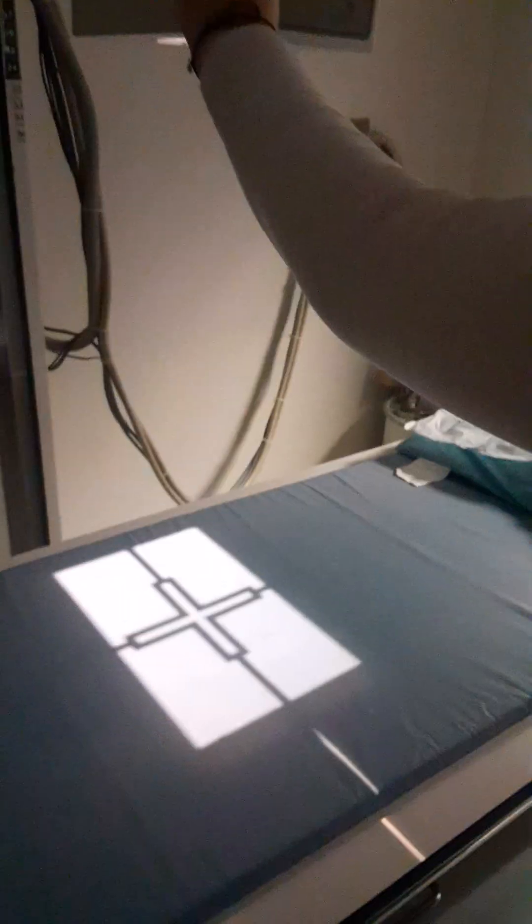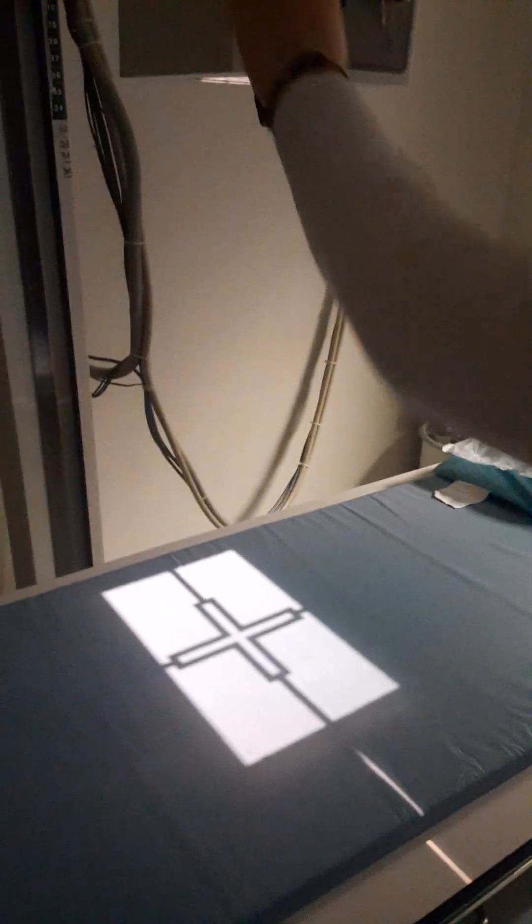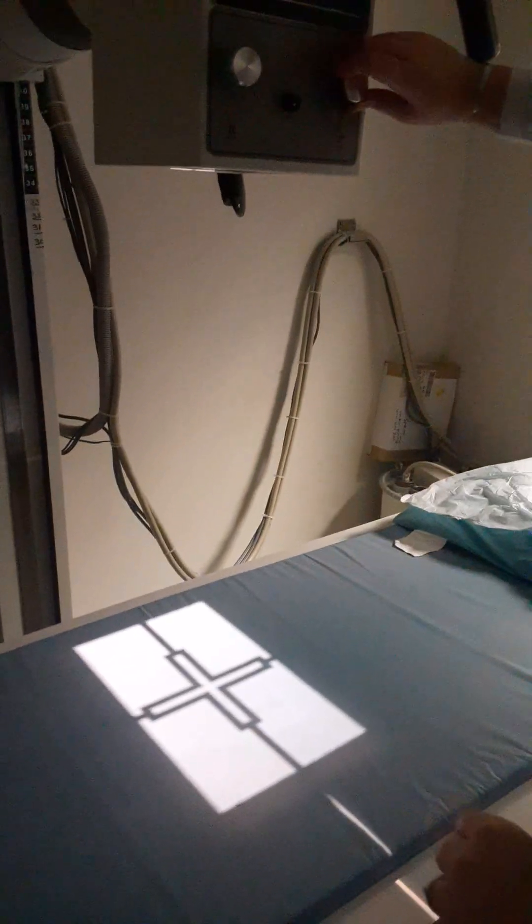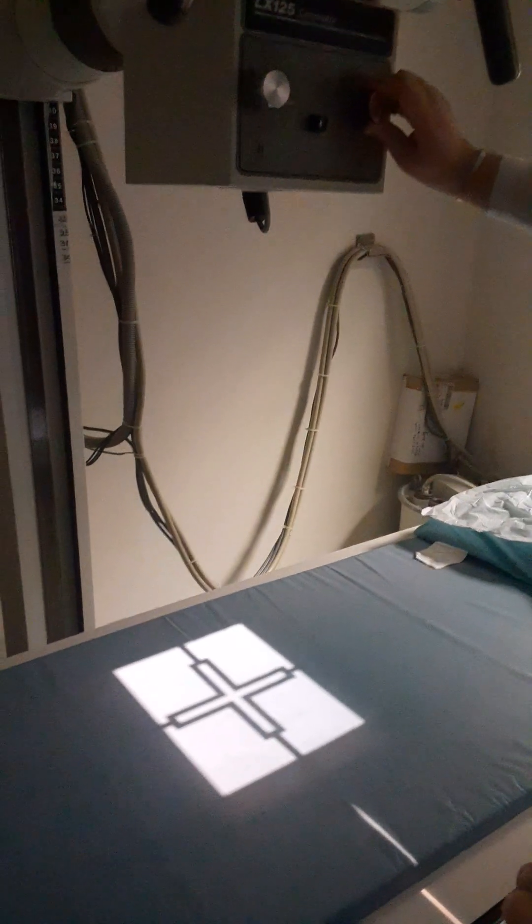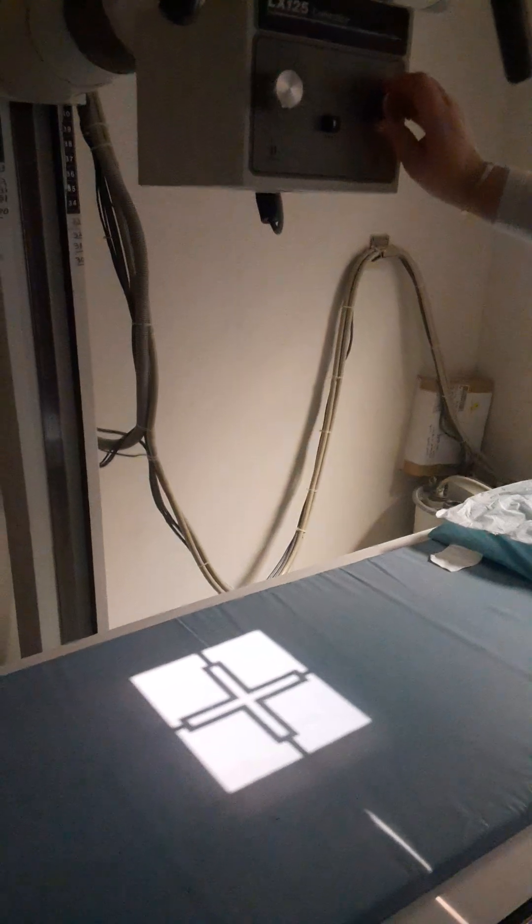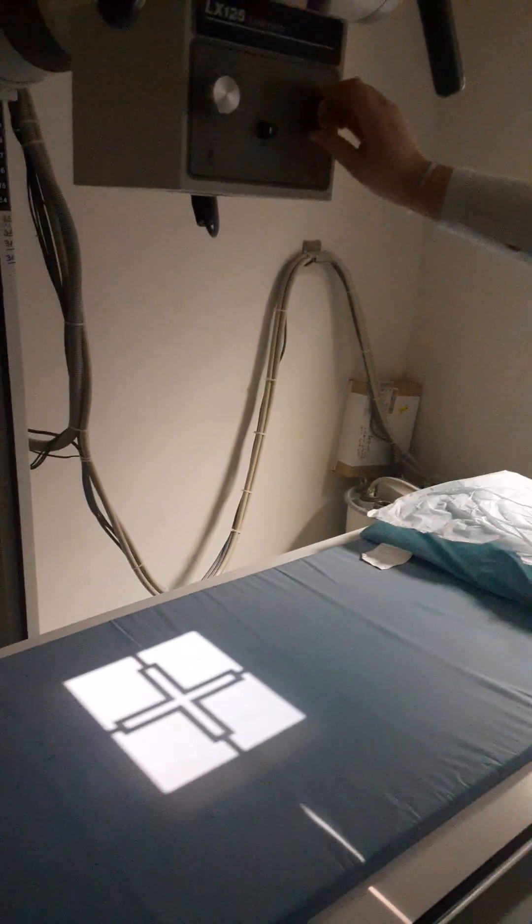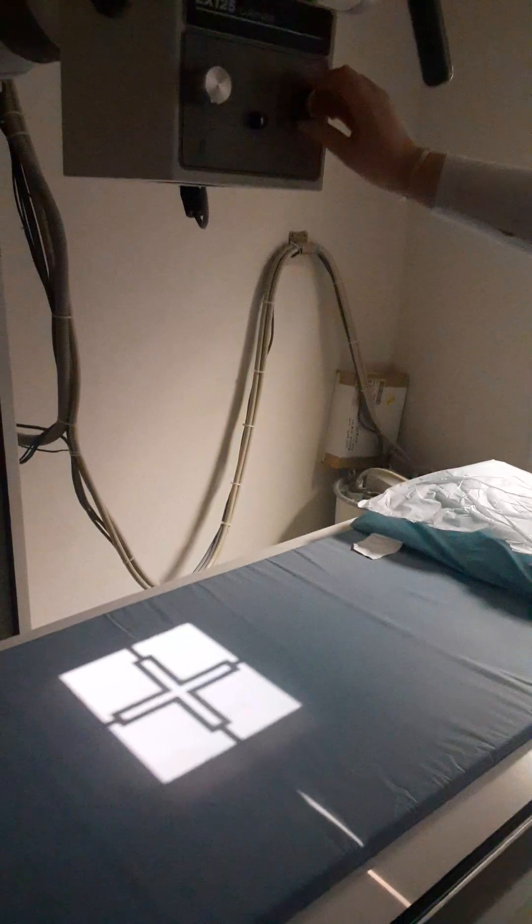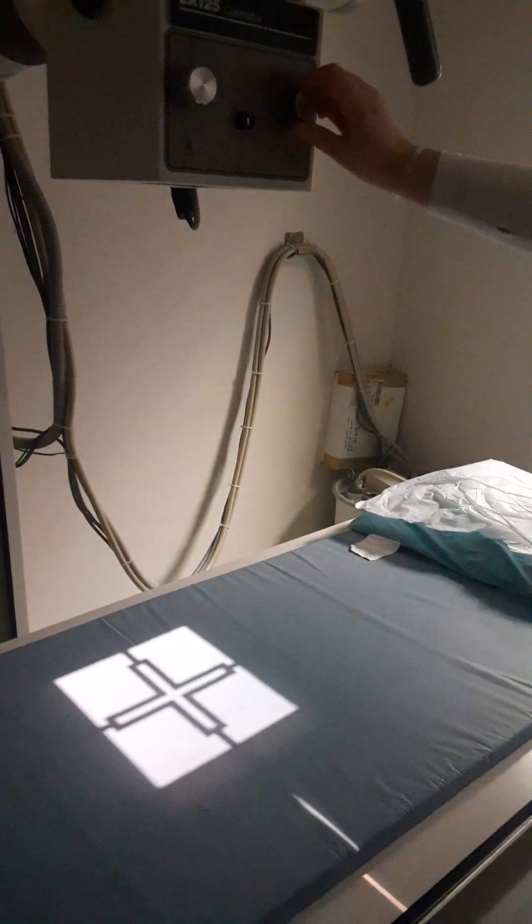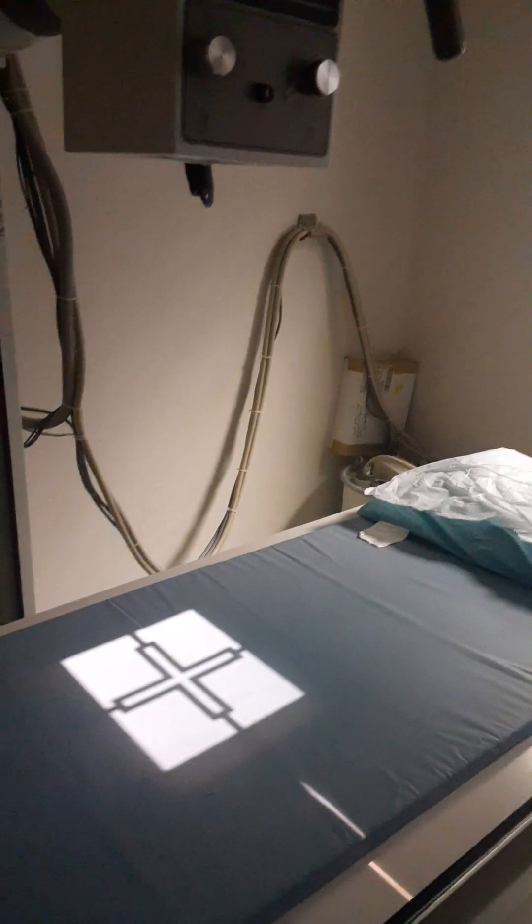Shine our light to make a square to make it look portrait, which is going from the head to the foot with our bigger number. So our 12 is going to be that way, and our 10 is going to be the side to side number.